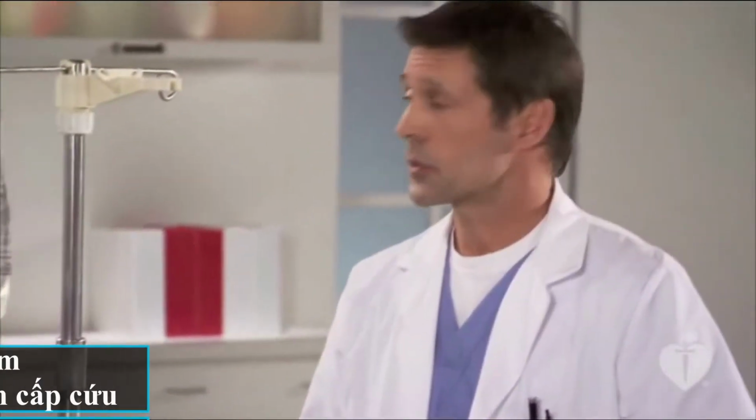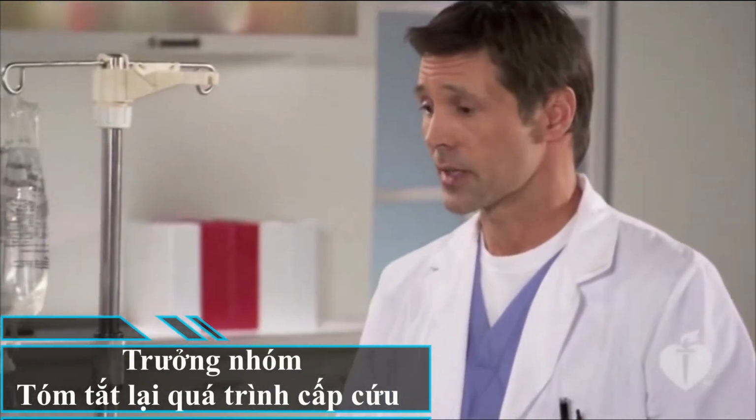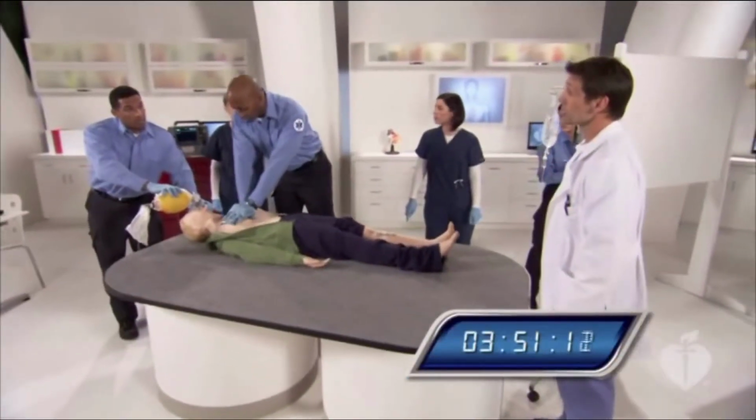Great. We've given 2 shocks and given 1 milligram of epinephrine. The next medication to consider is amiodarone. Dana, please prepare 300 milligrams of amiodarone. Trying 300 milligrams of amiodarone. Sam, are you getting good chest rise? Yes, and I'm being careful not to deliver ventilations too quickly or forcefully. Okay, great. Let's continue there.